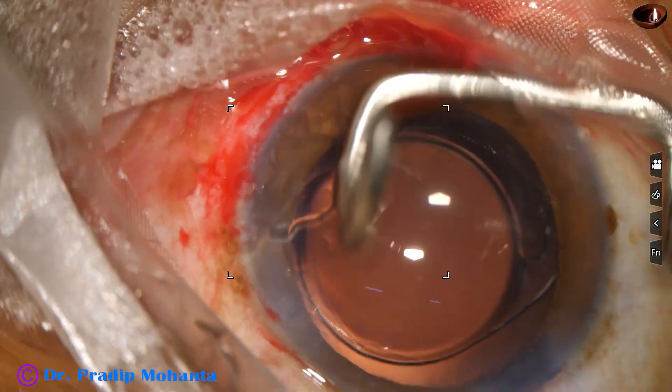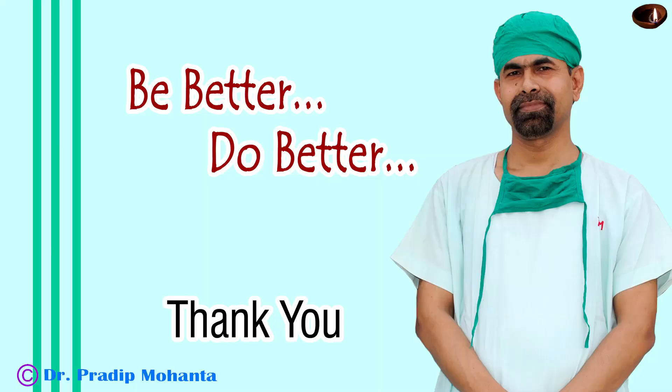This is a crescent blade being used to polish the corneal surface, and the case is concluded. Thank you very much for your attention. Hope this video will help you in developing your surgical skills. It will guide you whenever you want to do combined pterygium surgery and cataract surgery. Be a great surgeon and serve your patients with love, respect, empathy, and great surgical competence.